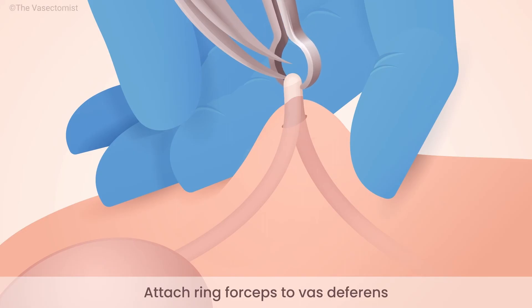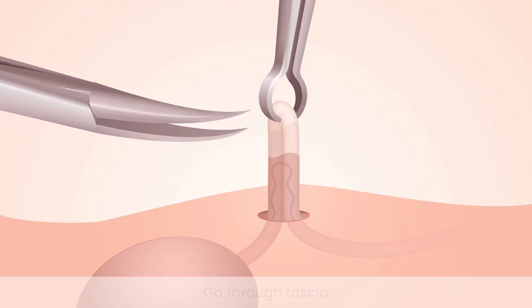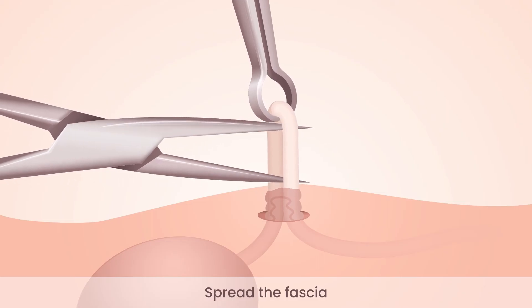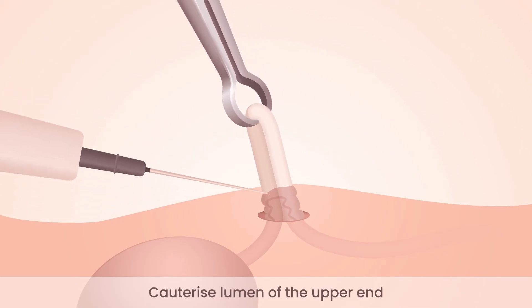However, the fascia has not yet been fully separated. Go just underneath the apex of the loop with the instrument, then use both blades and stretch the fascia downwards. Further work is required to ensure good separation of the fascia from the tube.